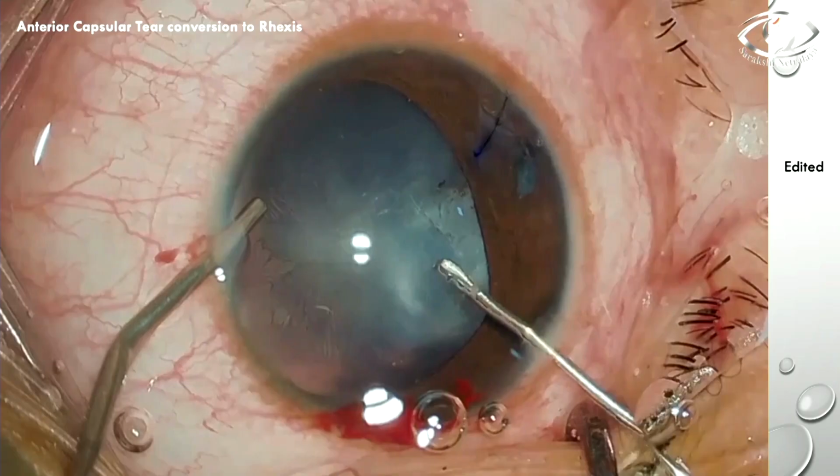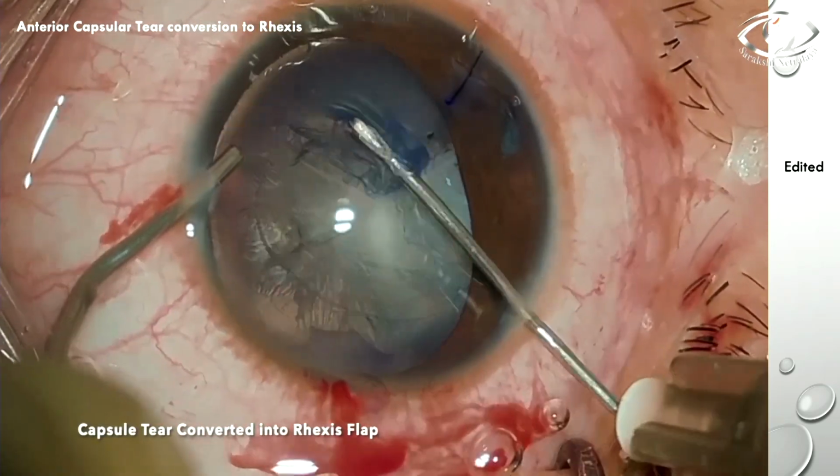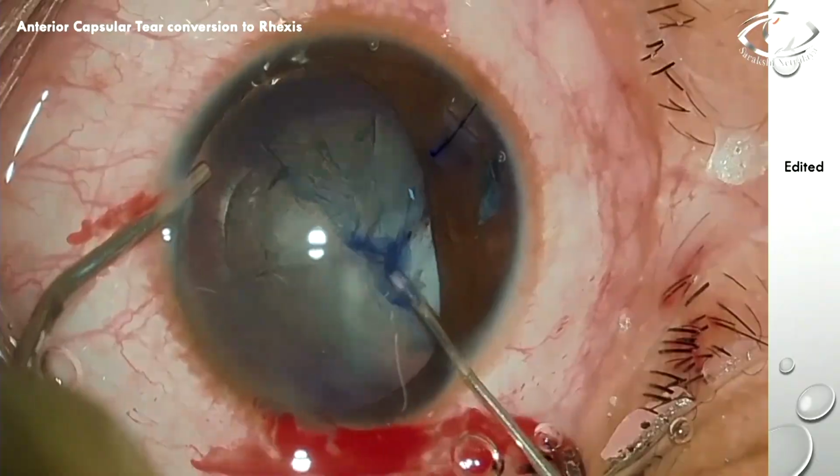Capsular related challenges: if it's an anterior capsular tear, you can just convert it into a rhexis and take it to your advantage, avoiding the previous tear.